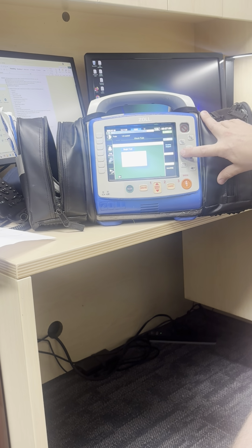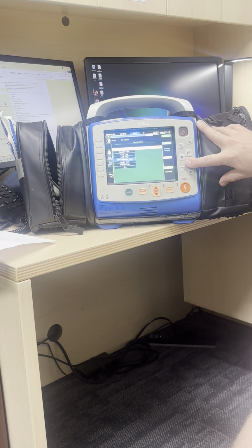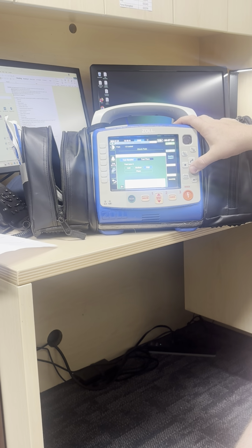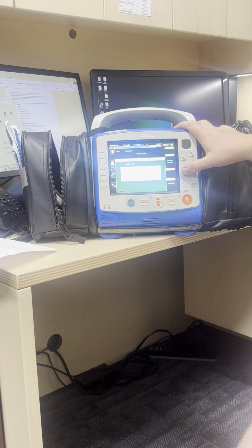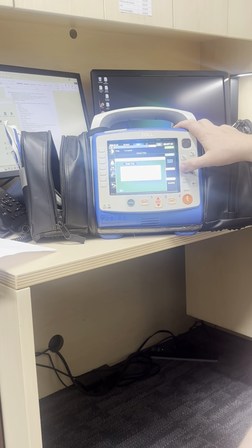It'll go from do not enter to the diamond and back a couple of times. The audio test tests the audio. And lastly, the printer test prints a bunch of alphanumeric characters to test the status of the printer.